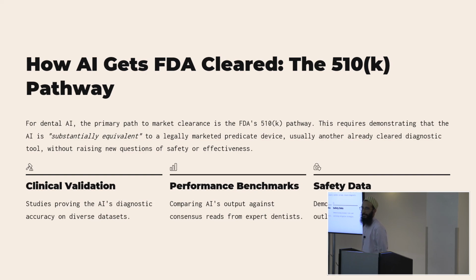What about hypercementosis? No, it doesn't show that. It's not very good at diagnosing that. So what did you say it will not diagnose? An OKC, for example. What's OKC? Oh, okay, like a remnant of that. It's not a cavity, so it doesn't matter.